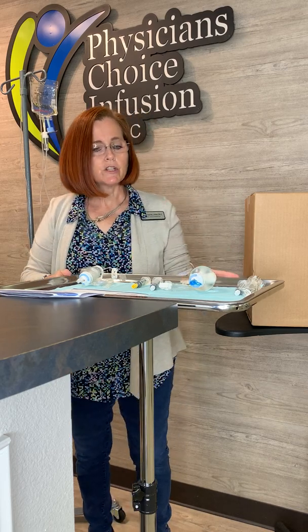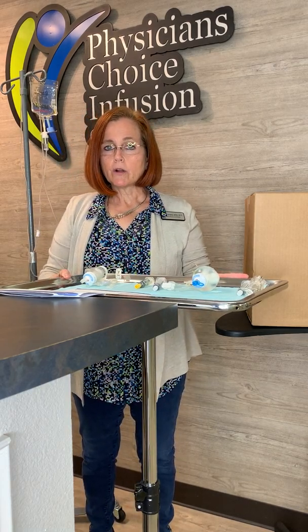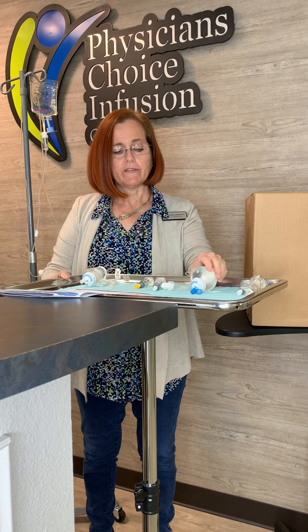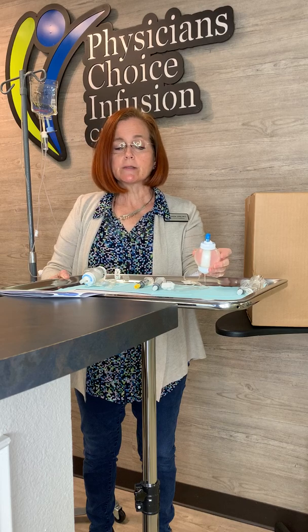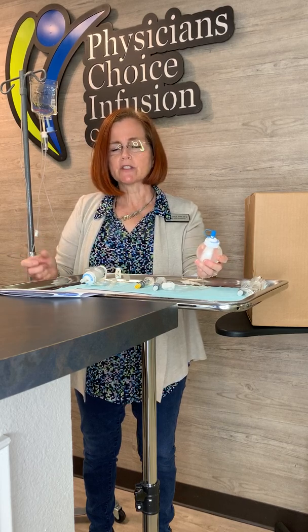The first thing you want to do is 30 minutes to an hour before you infuse your medication, take it out of the refrigerator and warm it up at room temperature. You don't want to warm it up in the microwave, on the stove, or under hot water — it can affect and change your medication. It needs to warm up on your counter to room temperature. The reason we do this is because cold medication can make you really cold and can spasm your vessels.